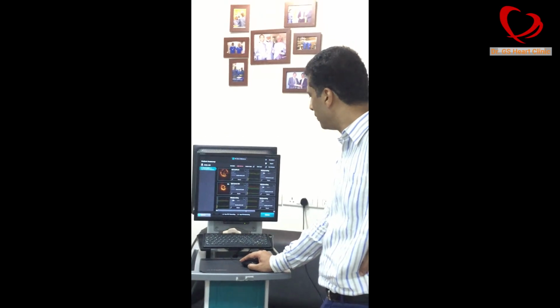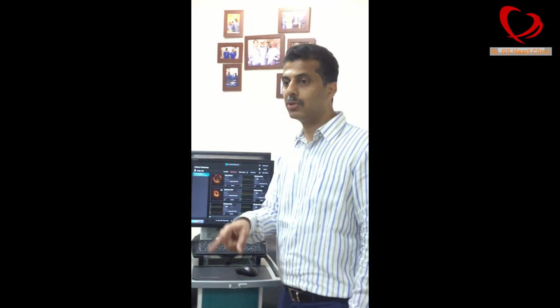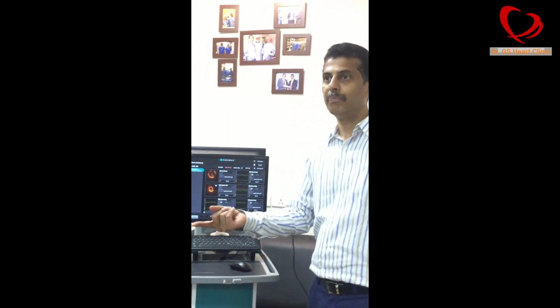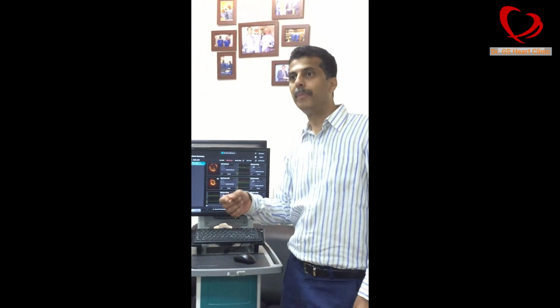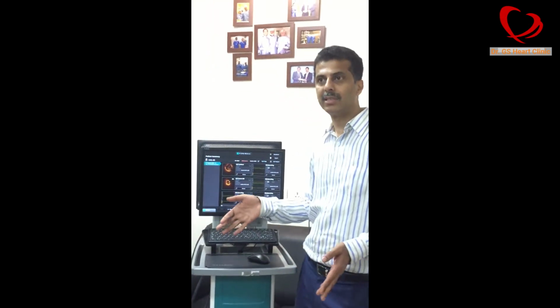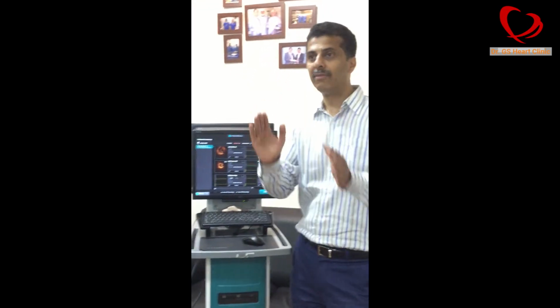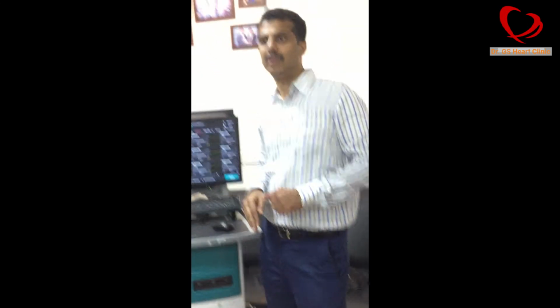Another OCT repeated? We keep repeating till we get a... See, the purpose of OCT is we also want to use it to see what stent result we have got. So that is a post-stent OCT. And because we already have an OCT with us, we use it to optimize before stenting and after stenting, until we are sure that we got the best result with stenting.